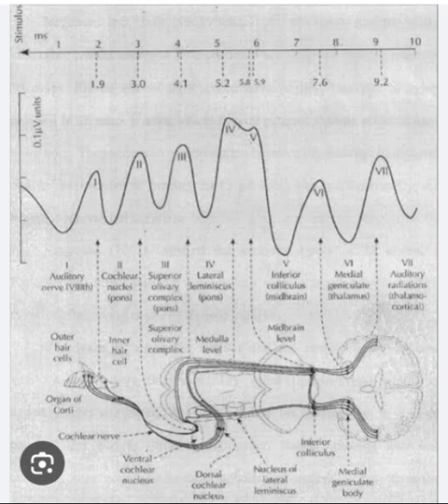Wave V is the most prominent and consistent component of the BERA waveform, exhibiting a distinct morphology and amplitude. It is relatively less influenced by individual variations and factors such as stimulus intensity, making it a reliable marker for clinical interpretation. As Wave V is the easiest to identify within the BERA waveform, it is routinely used as a marker to test a subject's hearing sensitivity threshold.